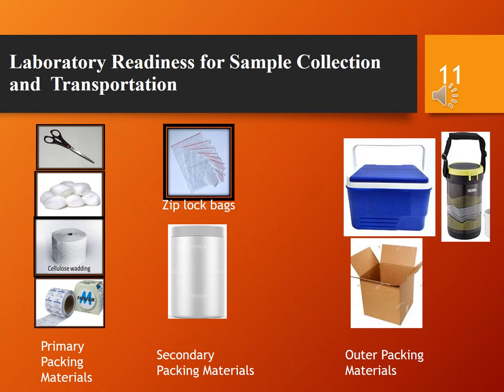Laboratory readiness for sample collection and transportation is important. Primary packing materials such as tissue paper, tape, and paraffin are required. Secondary packing materials, namely a large leak-proof secondary container such as a zip lock bag, must be present. Outer packing materials such as a thermocooler box or ice box with a hard board box are required.